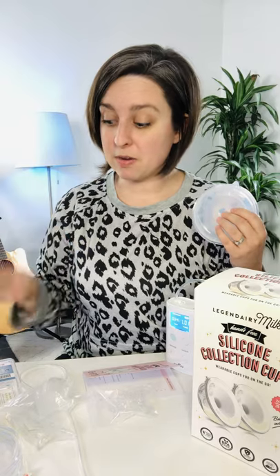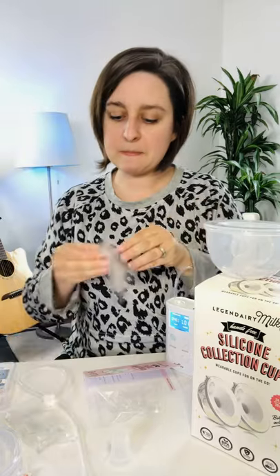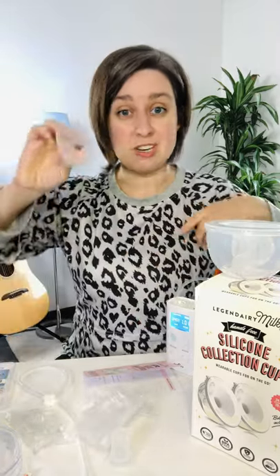I think the Freemie cups are 25 millimeter, so you just need to make sure you get the inserts that fit your cup. These are made for a 24 millimeter flange — that's what you need. There's a link in my bio to my Amazon storefront where you can find all of those in one spot.